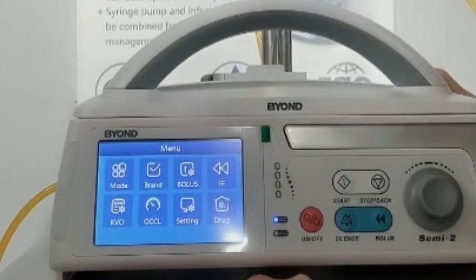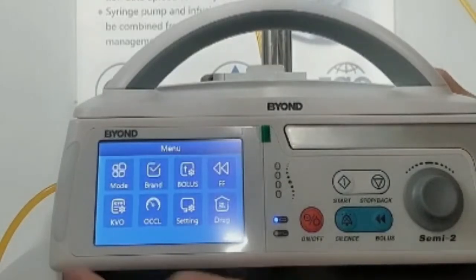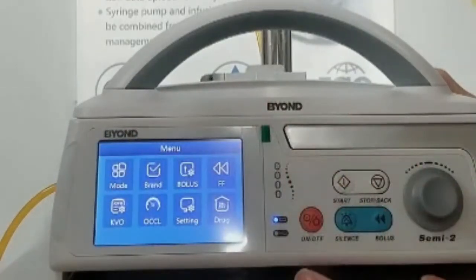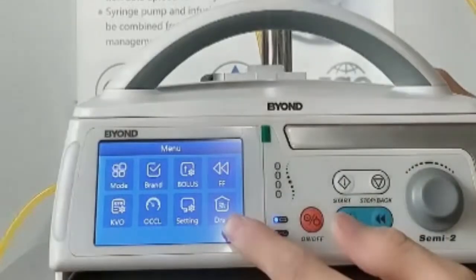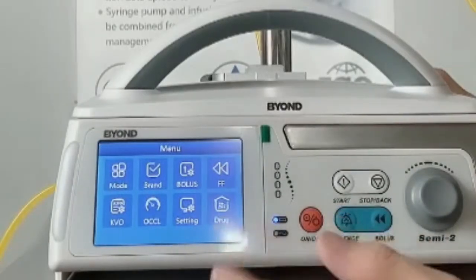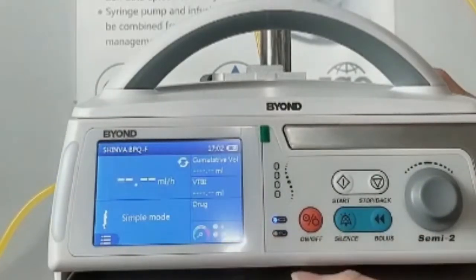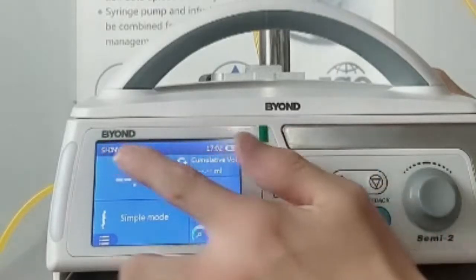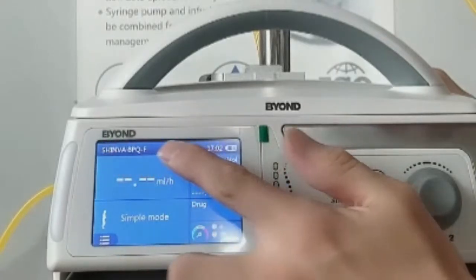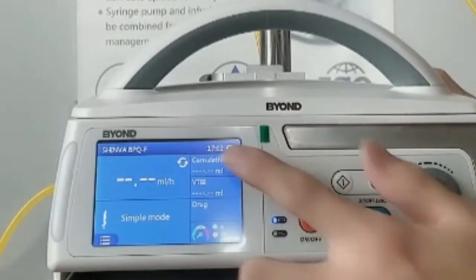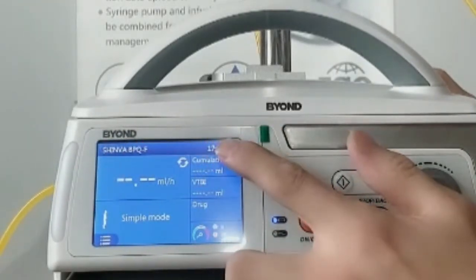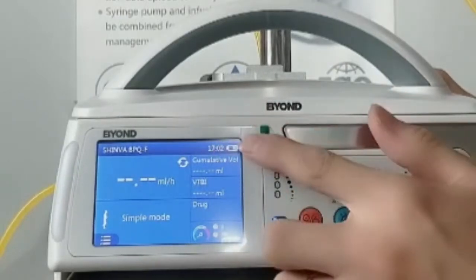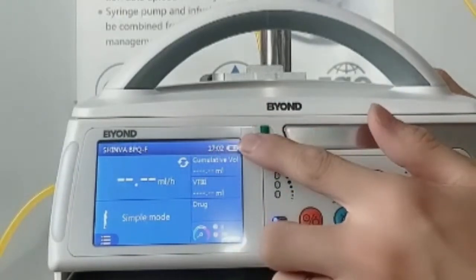This is the menu button. You can see the main interface in this menu. This is the Ivysight brand, the system time, and the battery status.